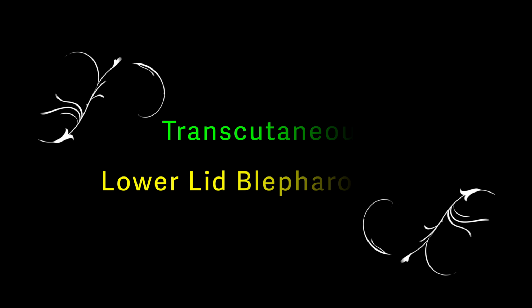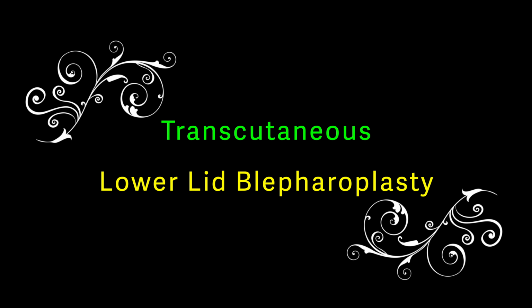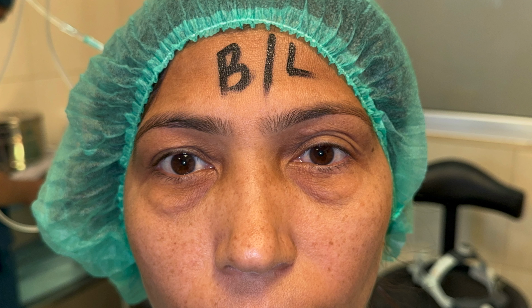This video demonstrates low-lid blepharoplasty. In younger patients under 50, fat prolapse without significant skin excess may be better managed with transconjunctival approach. However, in this case, a conservative transcutaneous approach was chosen due to mild skin redundancy.